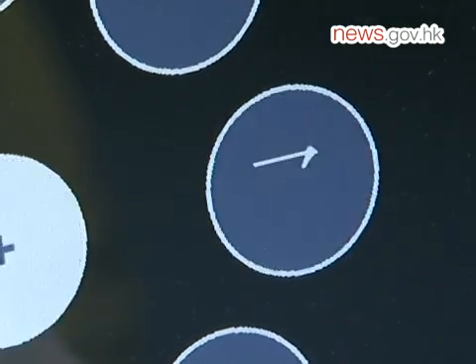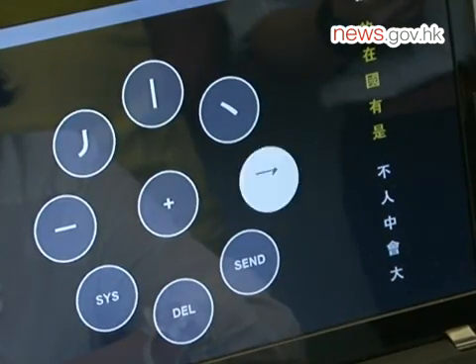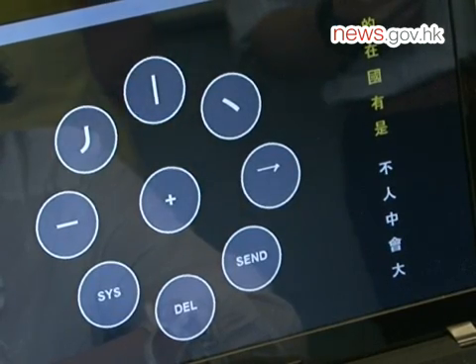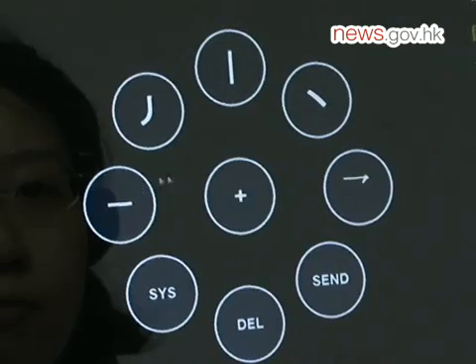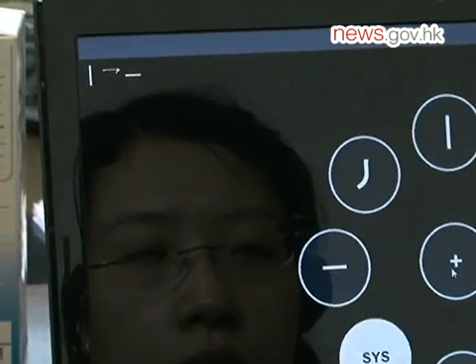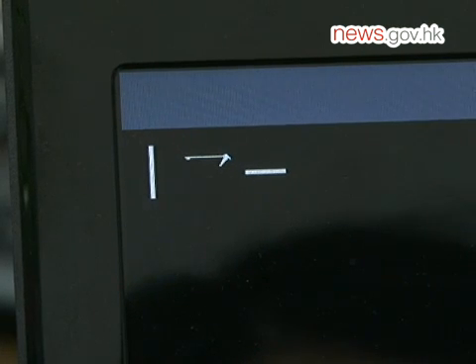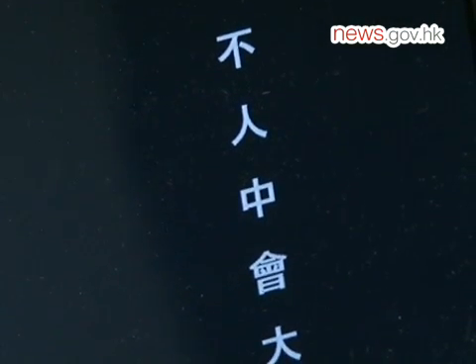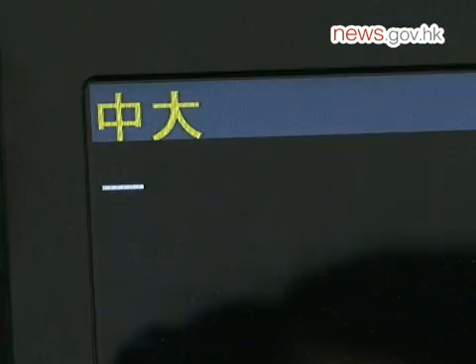To begin communicating, the user chooses one of 5 different strokes presented on the computer screen. When the one the user wants flashes on screen, it will trigger a particular brainwave detected by the encephalograph. The user would then choose the next stroke and the next. The software uses predictive text technology, so the system can guess which character the user wants within a short number of selected strokes.